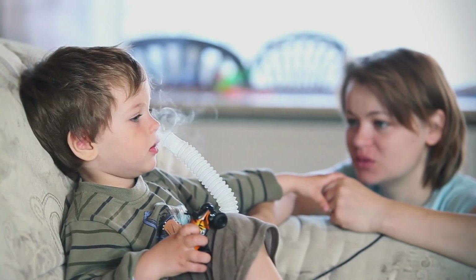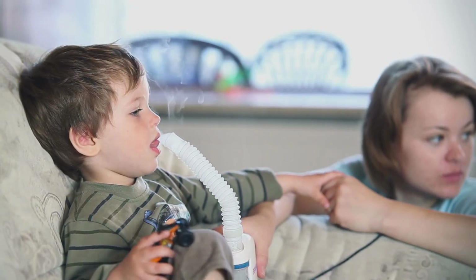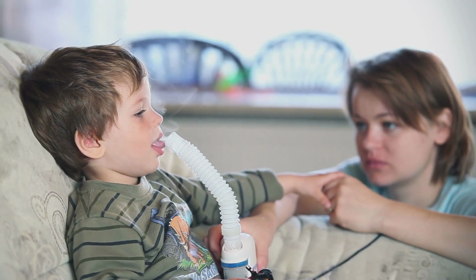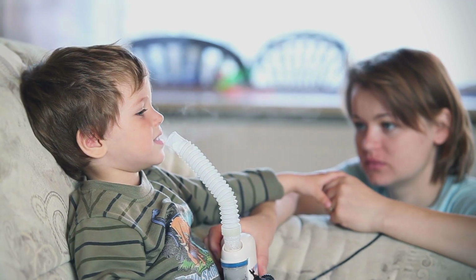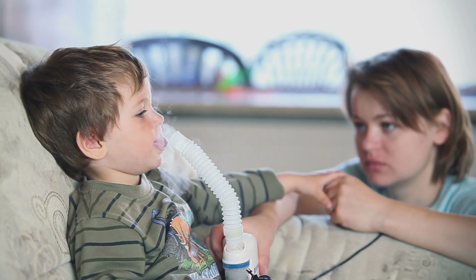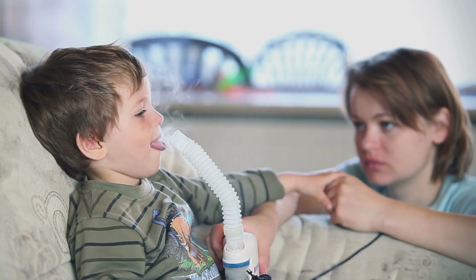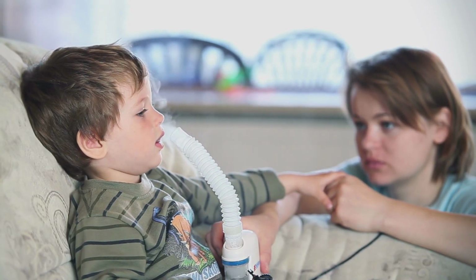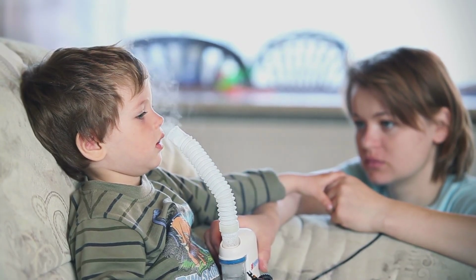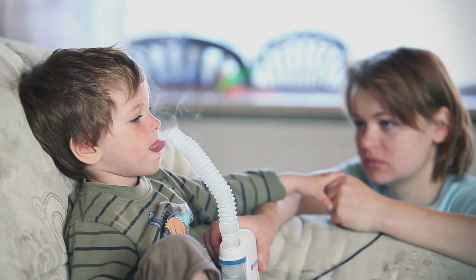A nebulizer is a device that converts liquid medication into a mist, allowing it to be inhaled directly into the lungs. It's commonly used for asthma, COPD, bronchitis, and severe allergies. This method especially benefits patients who struggle to use inhalers or need immediate relief from airway constriction.